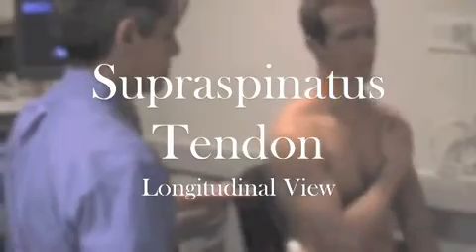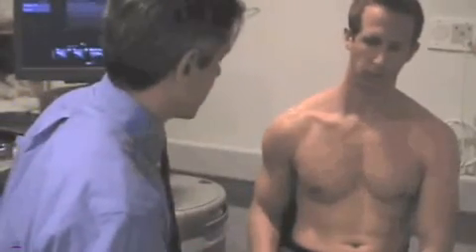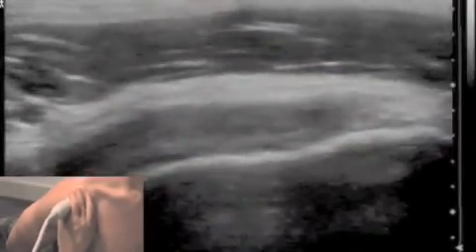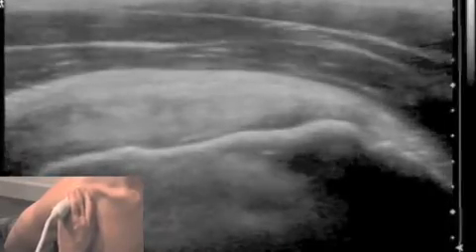To image the supraspinatus tendon in the longitudinal plane, the patient's arm is taken off the shoulder and placed behind the back to allow extension and internal rotation of the shoulder. The probe is positioned on the anterior aspect of the shoulder, just slightly lateral to the acromion, so that it is in line with the fibers of the supraspinatus tendon. The image produced should clearly show the supraspinatus tendon inserting on the greater tuberosity.